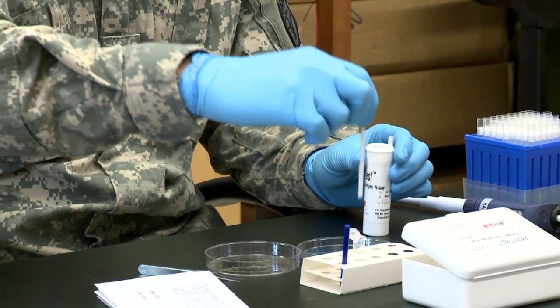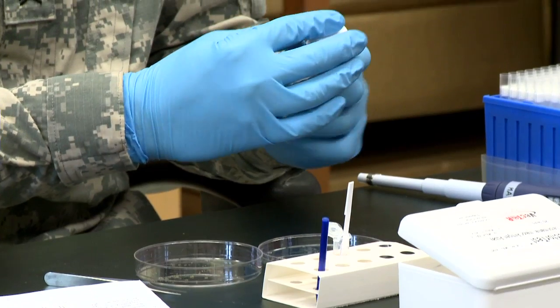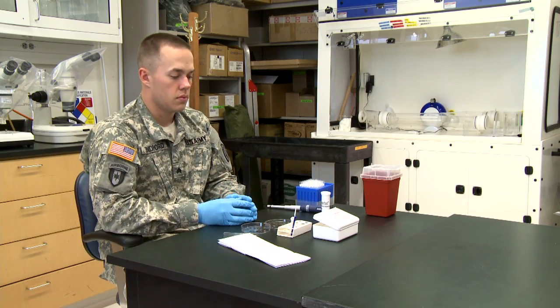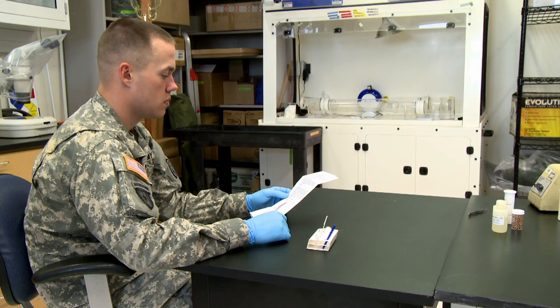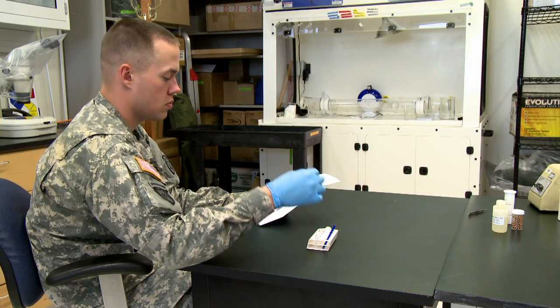Wait for the test to be completed. Results can be read approximately 20 to 30 minutes later. Determine the test results by removing the test strip and comparing it to the pictorial sample provided in the insert.